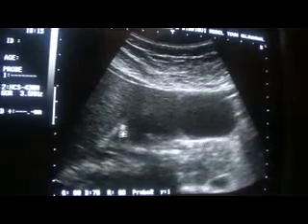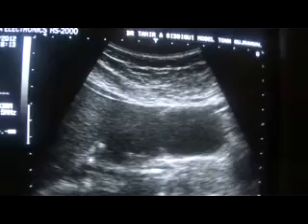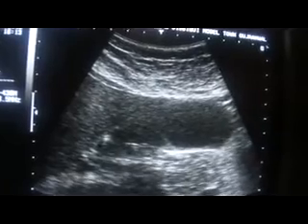It's not dilated. Maximum upper limit is up to 7 millimeters. The patient's CBD measures 5.1 and is within normal range. So no evidence of obstruction or any other pathology relating to the gallbladder or the bile ducts. This is again, I am repeatedly showing you intentionally how a cholesterol calculus looks like and the comet tail artifact.